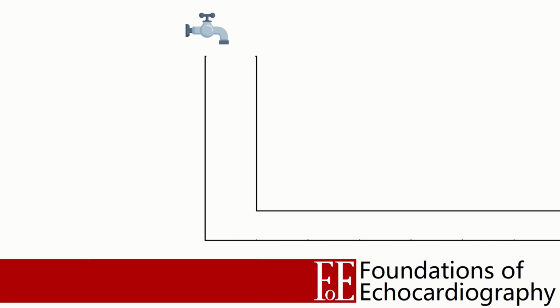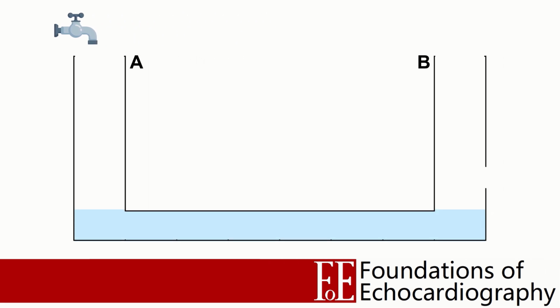So let's start by imagining we have two tanks connected by a long thin pipe. Tank B contains a large hole on one side, so cannot be filled beyond this point. Initially, the system is filled such that both tanks are level. The pressure across the entire system is equal, so there is no flow. We then start to fill tank A at a constant flow rate.